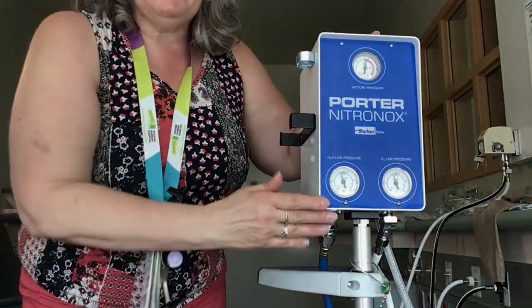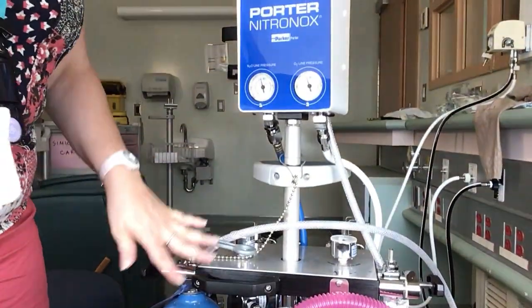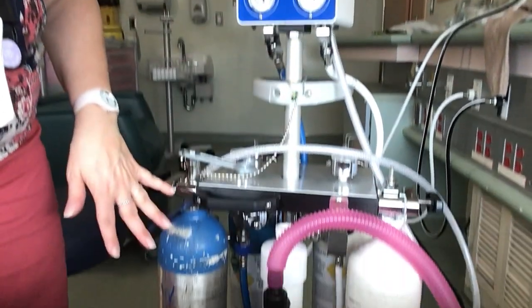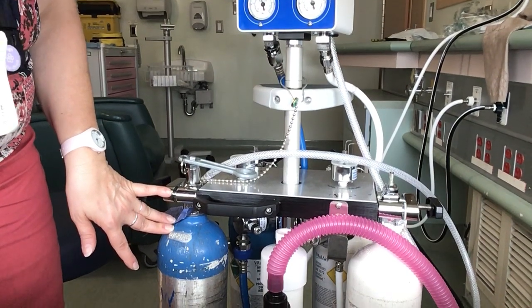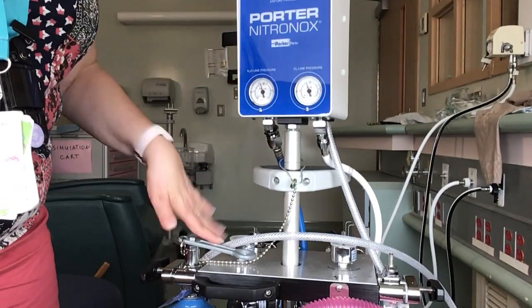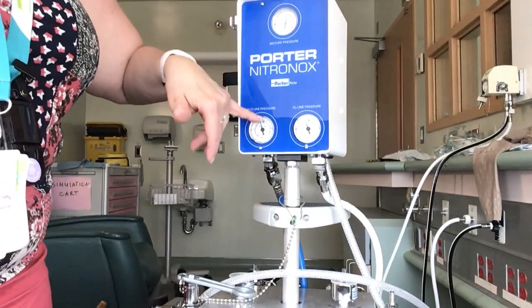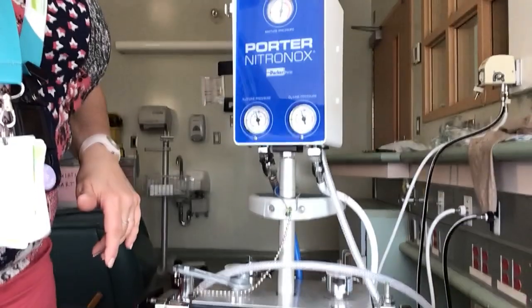The nurses are going to be assessing, when they turn the machine on, that the lines are all attached, and these lines do not need to be changed. We have 2 tanks on each of the units, so we can switch over if we run out of nitrous oxide or oxygen. They're going to be assessing line pressures and tank pressures, and making sure that our blender, that these are all within the green zone before they're going to be using, and there's some troubleshooting for them if they need it.